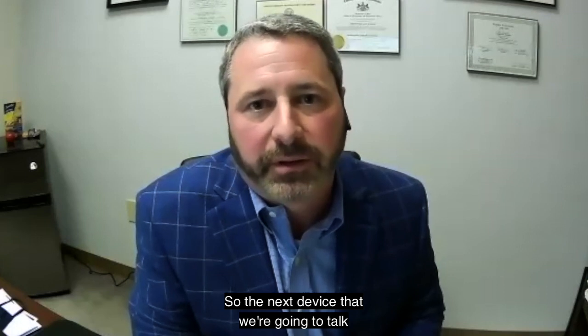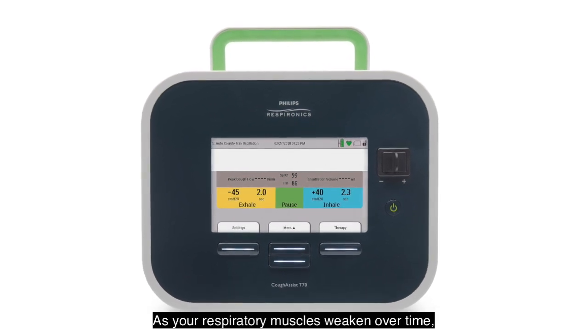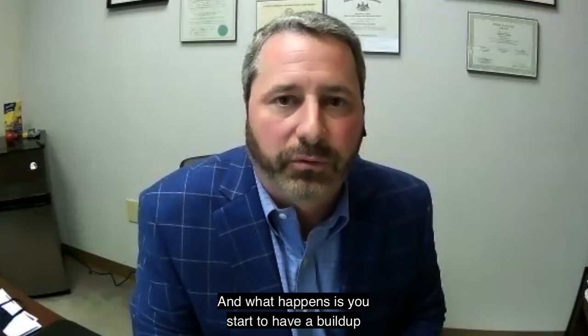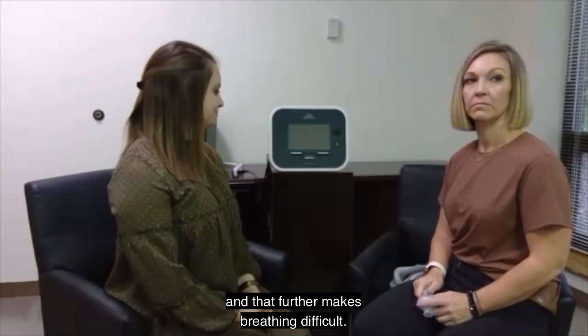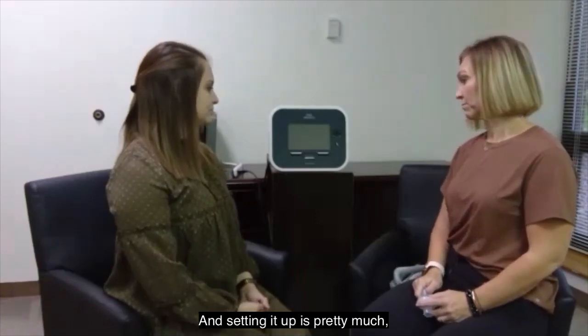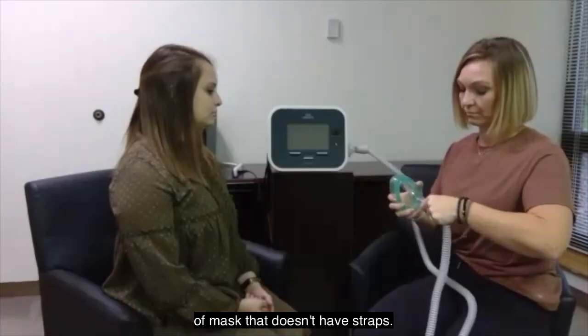The next device we're going to talk about is a cough machine. Why would you need a cough machine? As your respiratory muscles weaken over time, it gets harder to take a deep breath and harder to push that cough out. What happens is you start to have a buildup of secretions in your airways, and that further makes breathing difficult. The device we're looking at here is the Philips T70 Cough Assist. Setting it up is very much like using a Trilogy, and we use a different type of mask — it doesn't have straps.